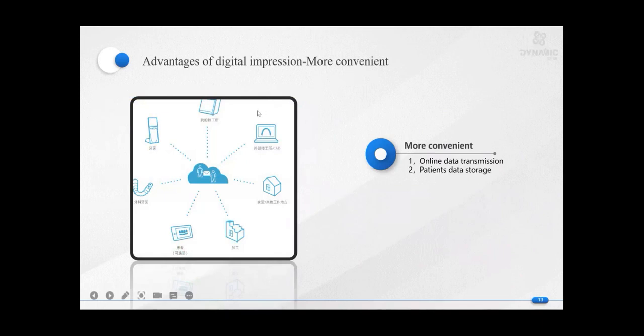So in the traditional impression process, when we complete the model taking in the clinics, we have to send the model to the laboratory by express. And there are many uncertainties in the transportation process. The first is that the express delivery time is uncontrollable. Second, the model may be damaged during the express transportation. The third one is the shipping costs, etc. All of these conditions will affect the patient's tooth model arriving at the laboratory on time.